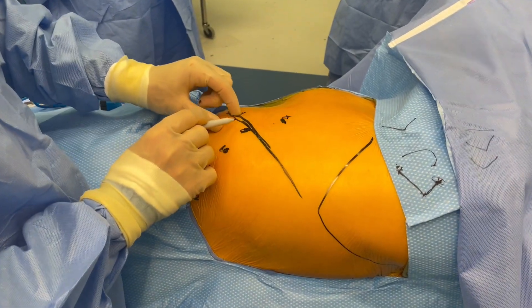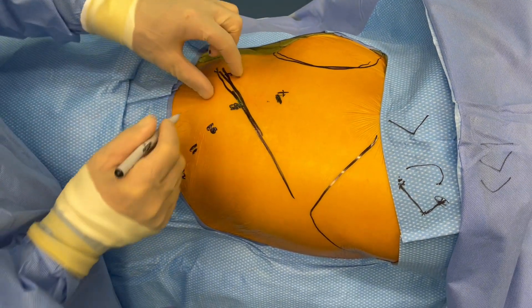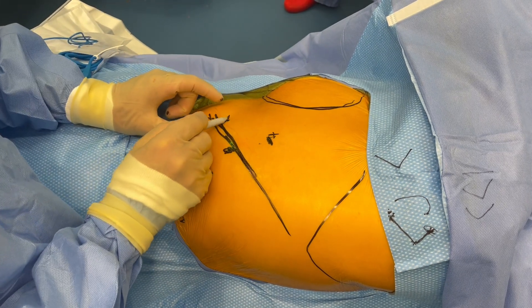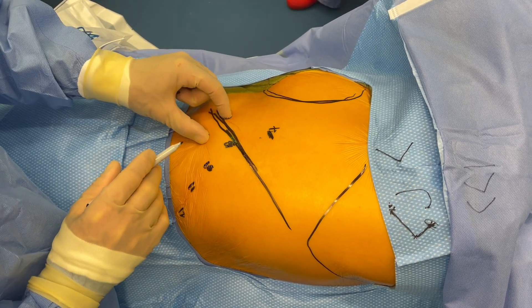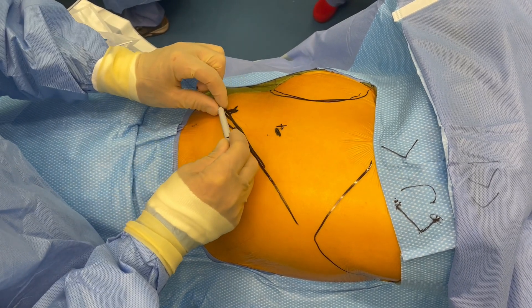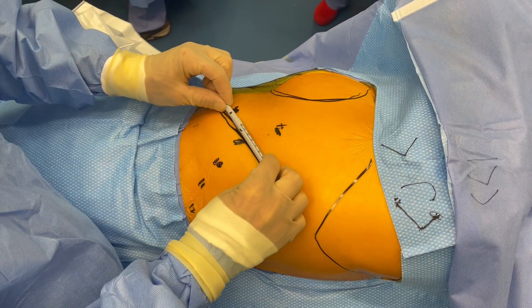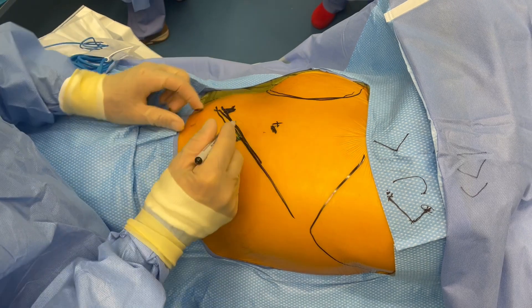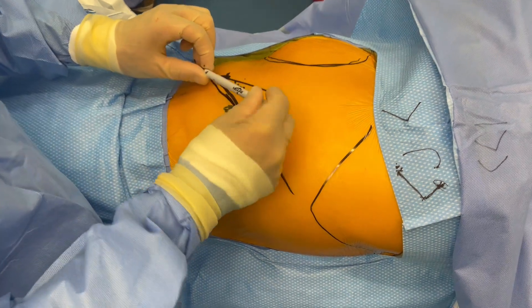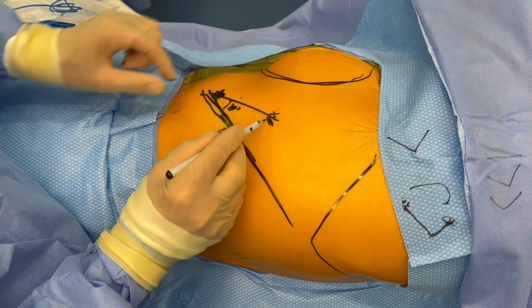You know that if you go to this very lower part, here's the patient's contour of her breast — you don't want to be in her breast tissue. This lower port then has to be in the chest; it can't be in the belly. So that's your rate-limiting step. But you don't start there — you start with the camera. You take that port and go on the rib, cheating up at about a 45-degree angle, and you go 8 centimeters from here. So if here's this incision, 8 centimeters puts you right there. That's how you start.